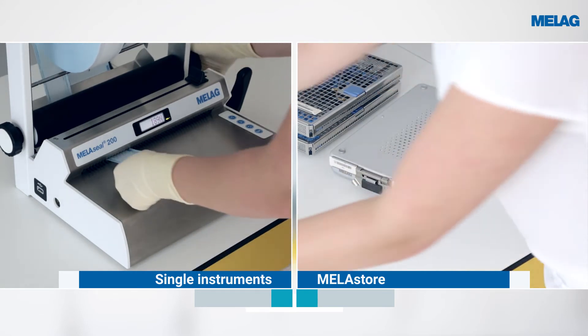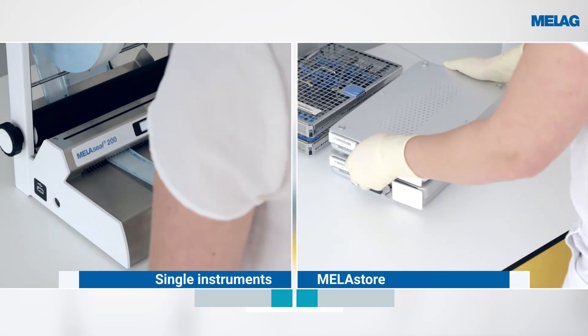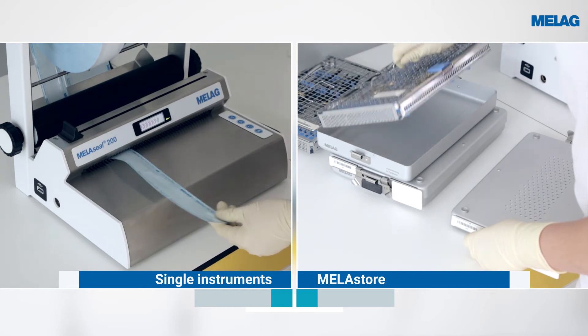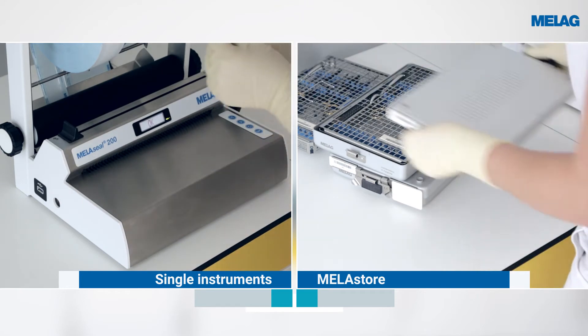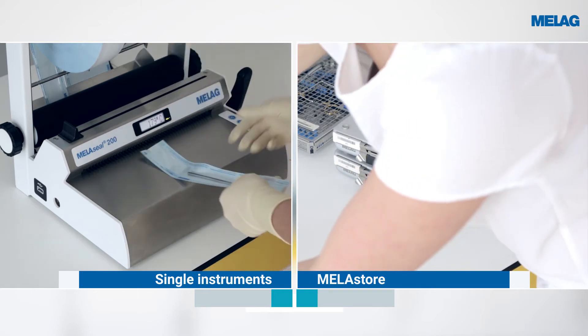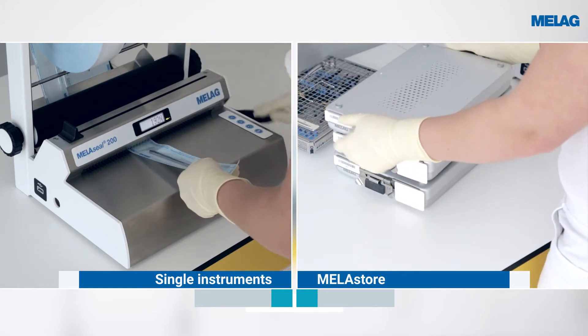The packaging process with the sealing device is shown on the left-hand side of the picture. The right-hand side shows the packaging process with the MELAstore system. The MELAstore boxes enable safe packaging of the MELAstore trays.